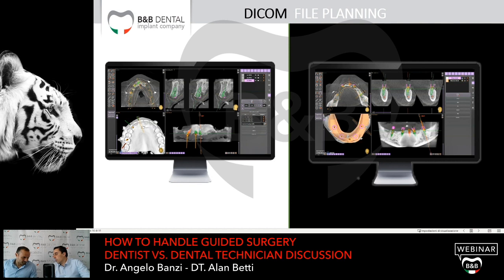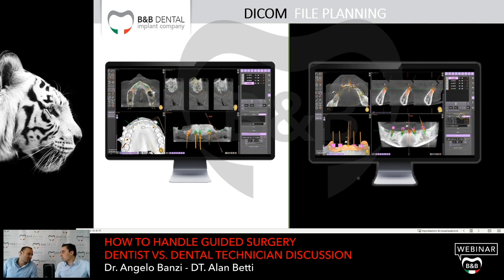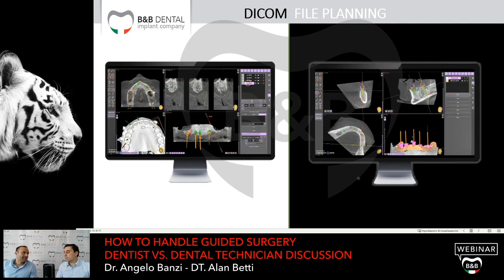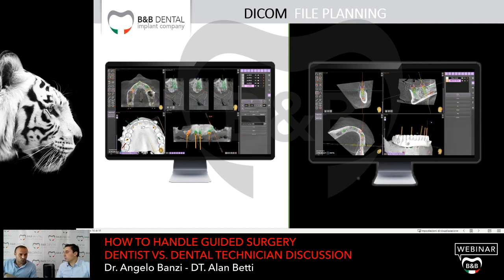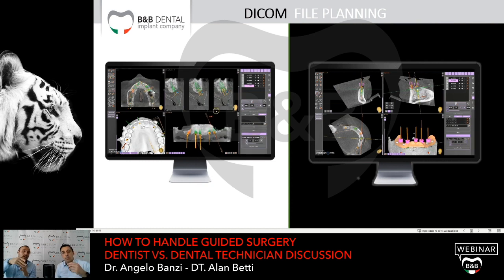According to the knowledge and the experience of the dentist, maybe sometimes he wants to place it at bone level. I prefer 1 or 2 millimeters under the level of the bone. In that case, it happens that the bottom part of the sleeves can enter into the soft tissues, or touch the papilla, or maybe because the inclination of the implant is too buccal or too lingual or too mesiodistally inclined, it can touch the soft tissues.